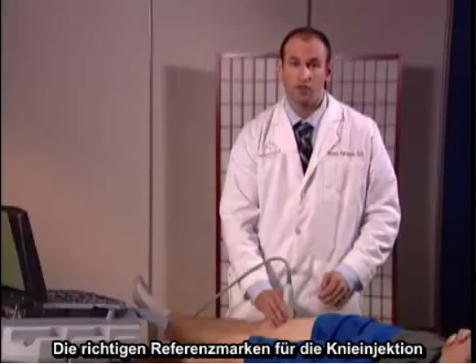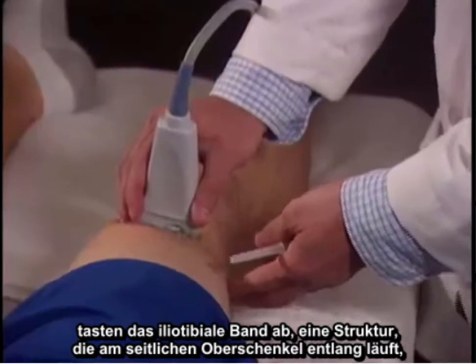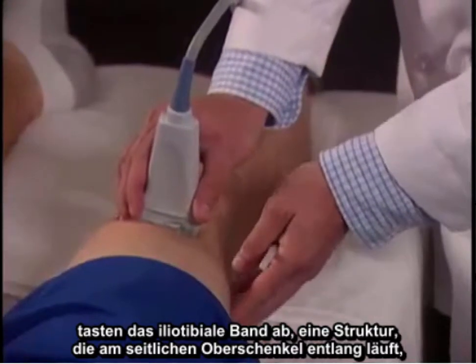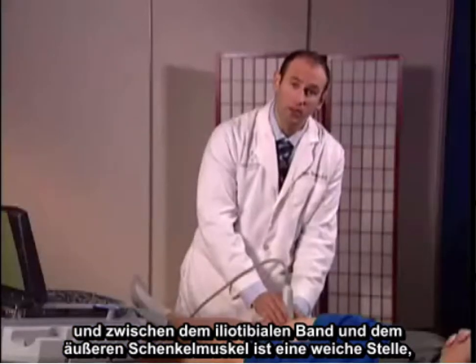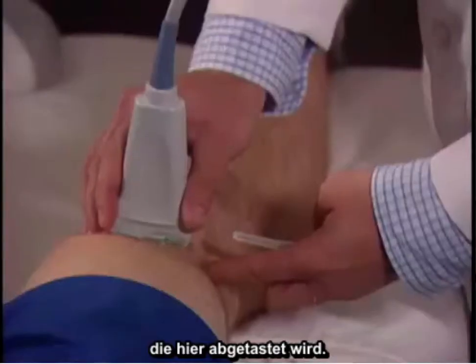The proper landmarks associated with the knee injection are palpating the iliotibial band, which is a structure that runs down the lateral thigh. In between the iliotibial band and the vastus lateralis is a soft spot palpated right here.